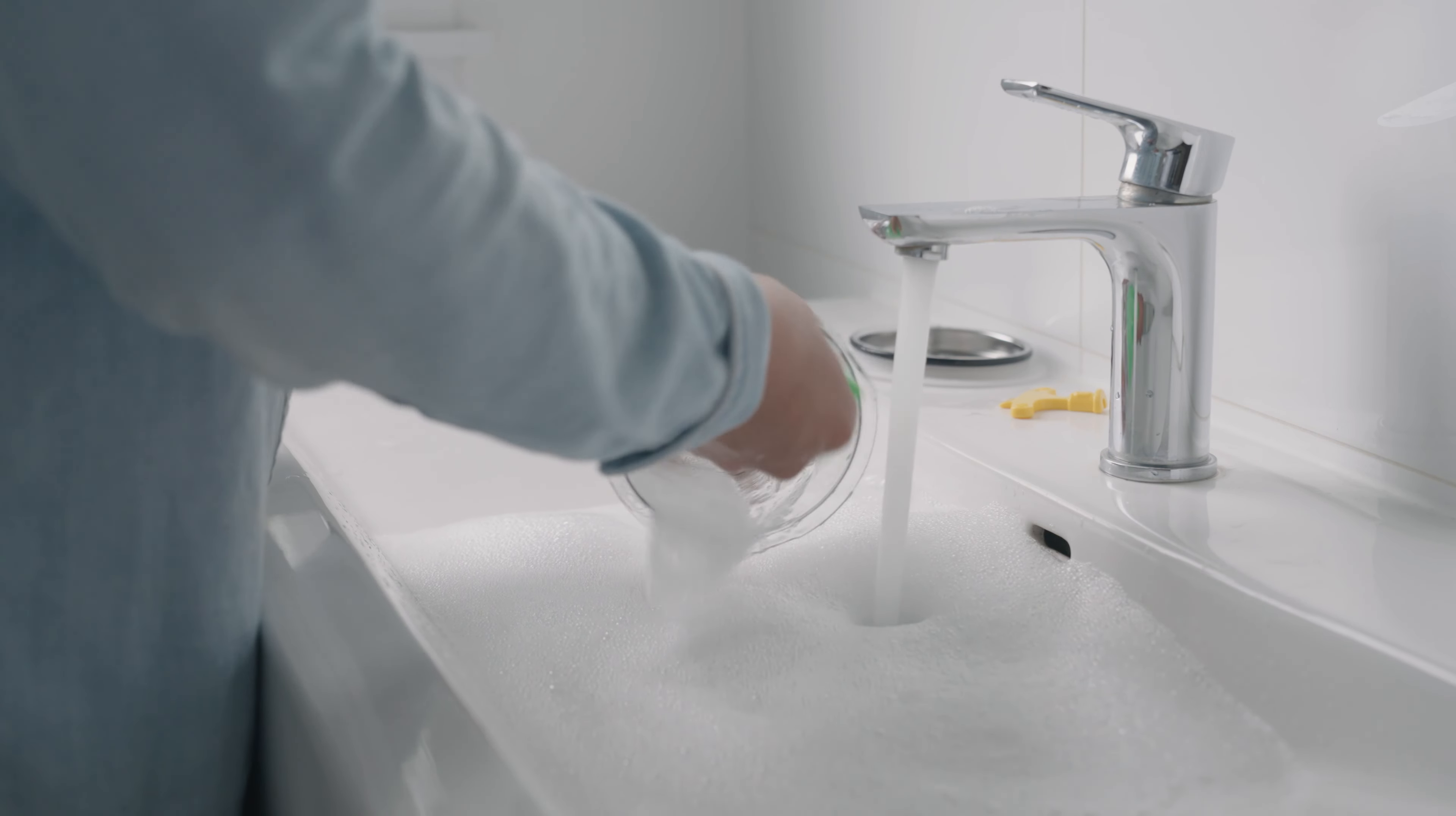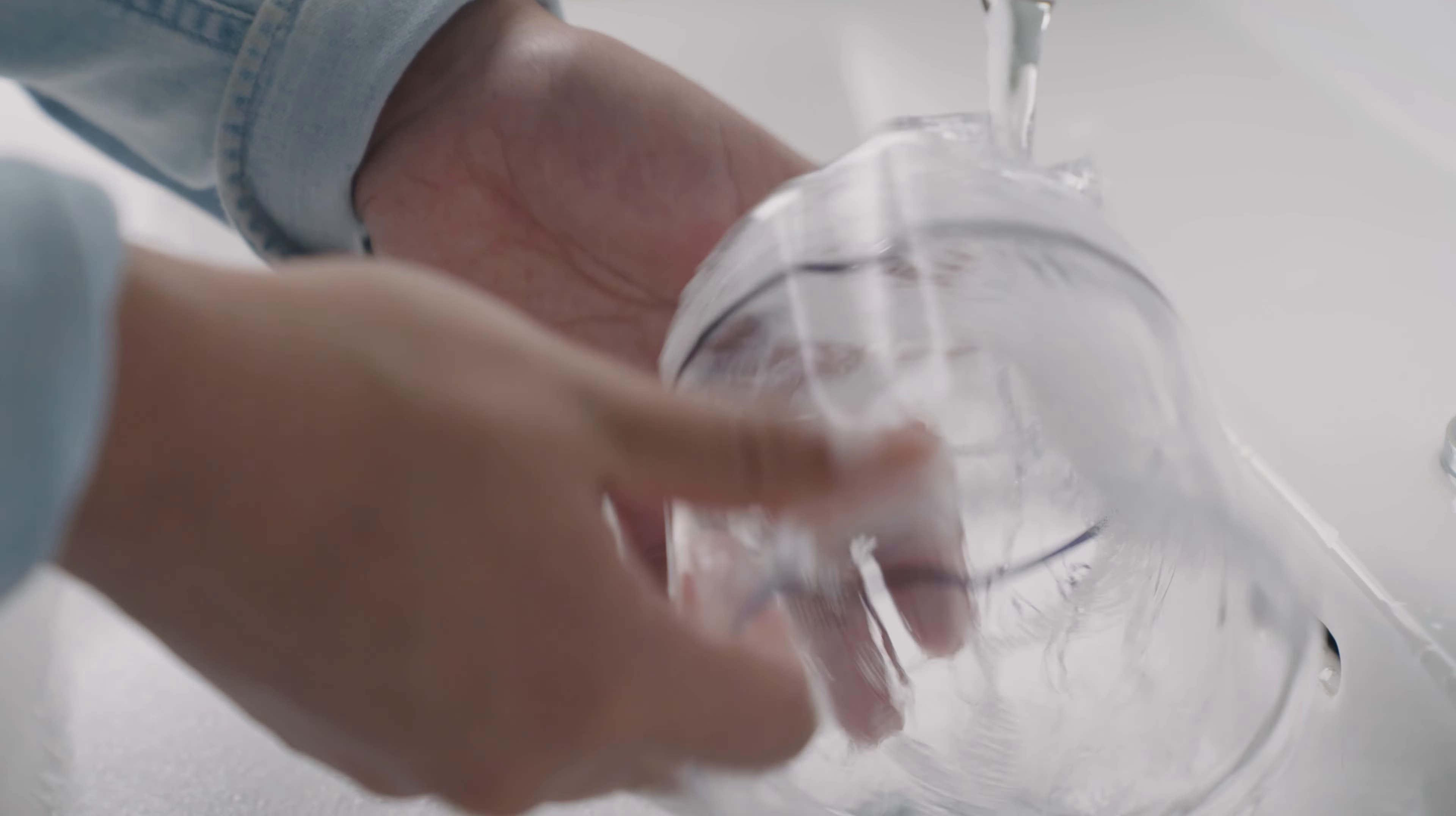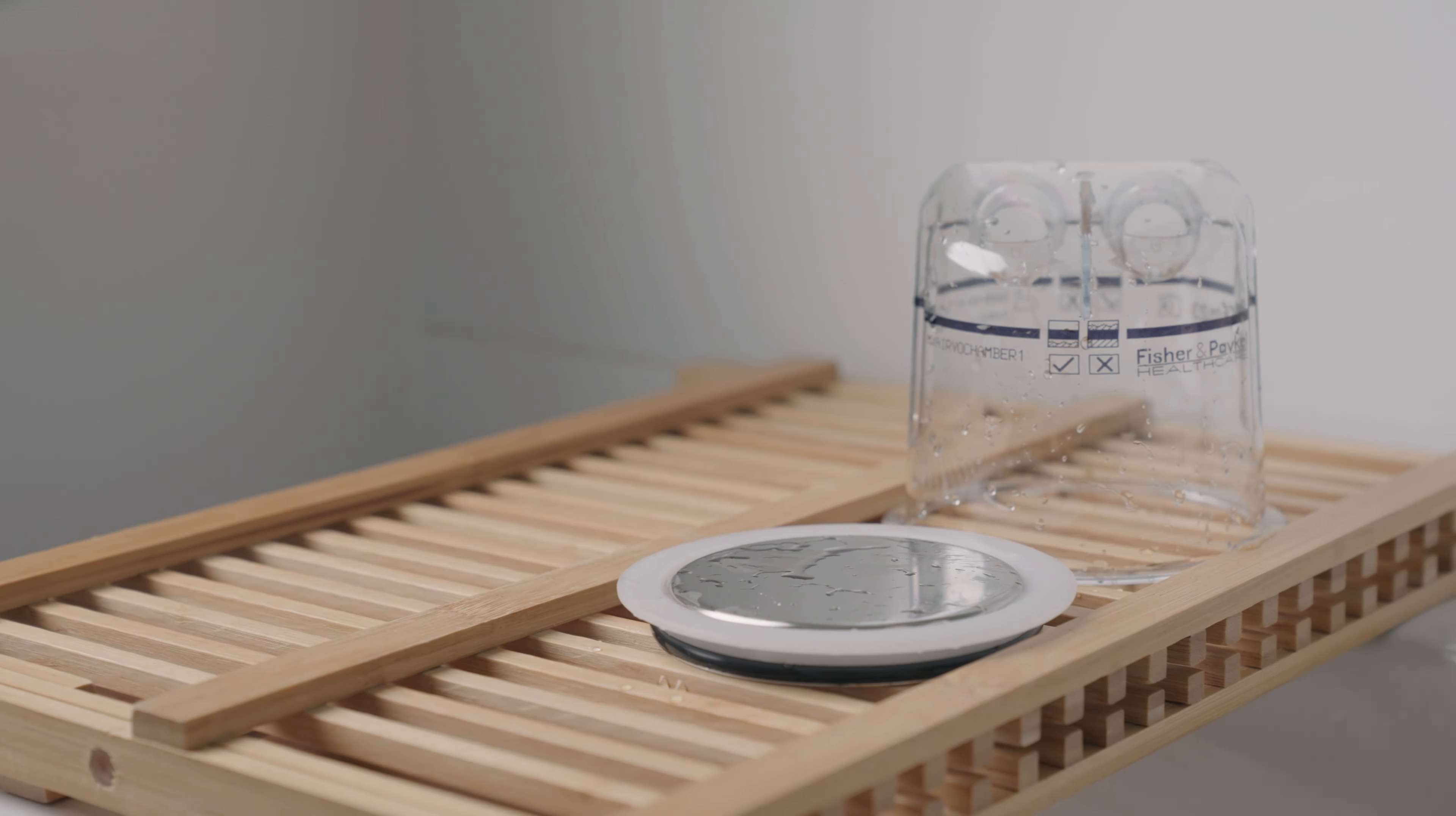Hand wash the chamber parts in warm water with a mild dishwashing detergent. Then rinse the chamber parts thoroughly in fresh water, ensuring the soap residue is removed. Leave the parts out to dry, being careful to avoid direct sunlight or heat.